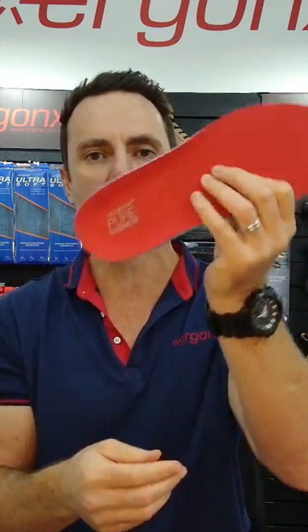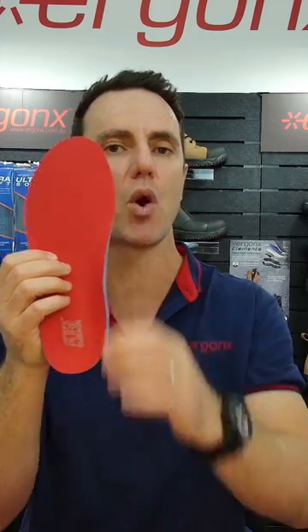Take a look at the Ergonix Pure Cushion if you need an orthotic insole that's very highly cushioned with only moderate arch support.